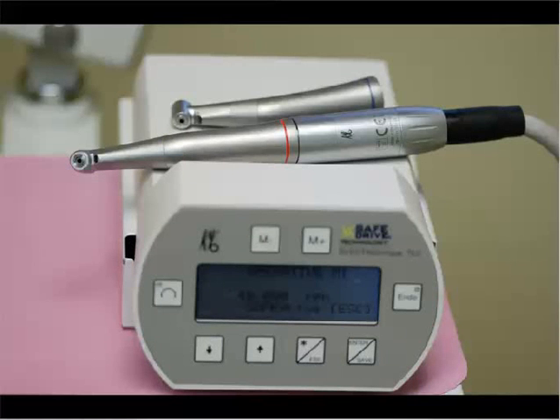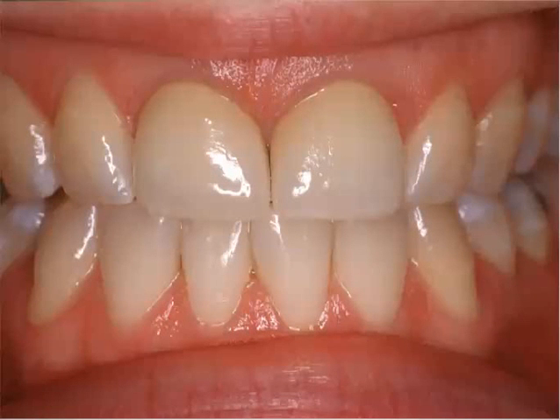The other piece of equipment which I think really lends itself towards precision and accuracy is an electric handpiece. These electric handpieces allow us consistent torque. They allow decreased heat production, noise production, increased cutting precision, and defined margins. If you haven't had a chance to utilize these, they offer a great deal of precision and definition we can't get with our regular air turbines. So if you're at a trade show or you want to demo one of these in your office, you'll find out how beneficial they can be when we talk about margination, delineation, and definition. These can really offer a lot to us from that standpoint.